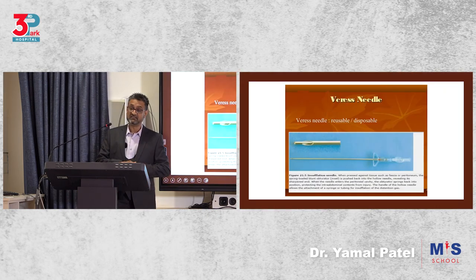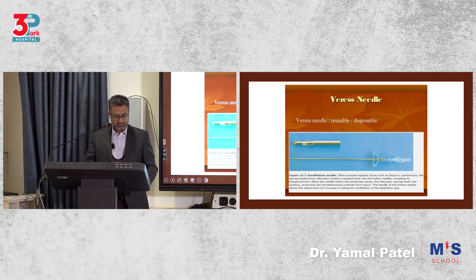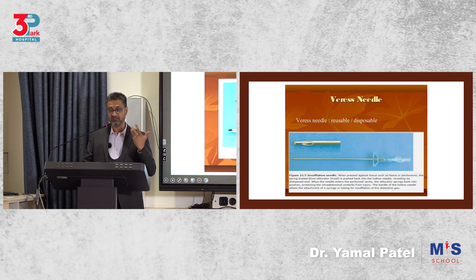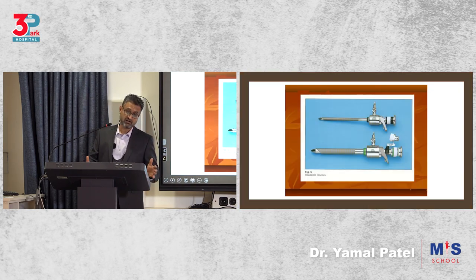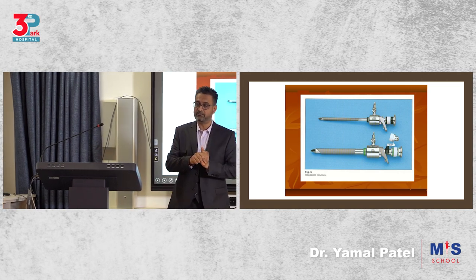You must have discussed the Veress needle. I'm not going into this. Remember, this is an overview. So what is the Veress needle used for and how does it work? What are our trocars? I mean, the ports. So we have a trocar and a cannula together as a port.